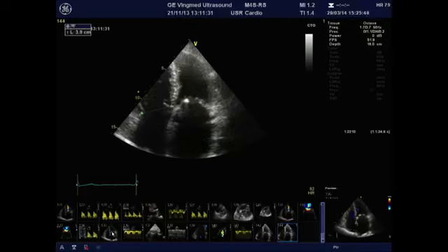So I think that this case perfectly emphasizes the importance of assessing the valvular regurgitation and stenosis using the adequate methods, and we should remember that one valve may act on another valve by changing the loading condition and the flow conditions. So the key points of this examination are that we have to avoid confusion between mitral flow and aortic flow, for example, that conventional measurements can be wrong, that we have preferentially to use effective regurgitant orifice and planimetry measurement, and finally that we must not forget the tricuspid valve, which can play an important role in the management strategy.